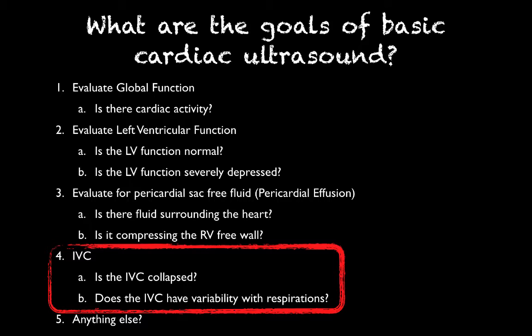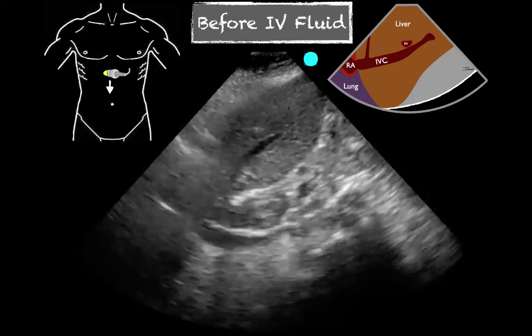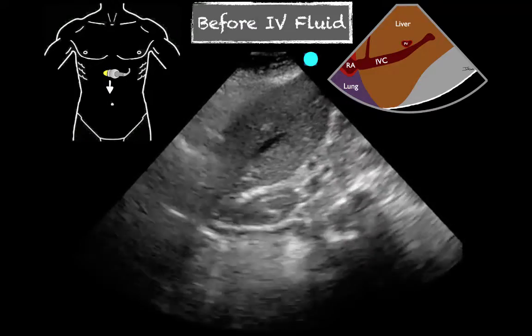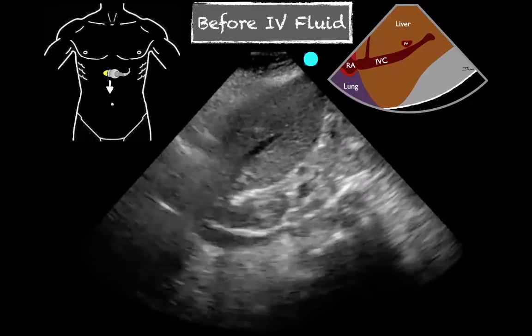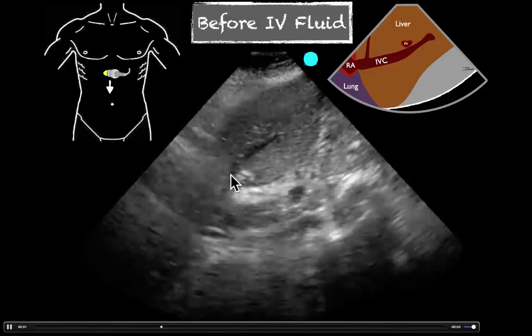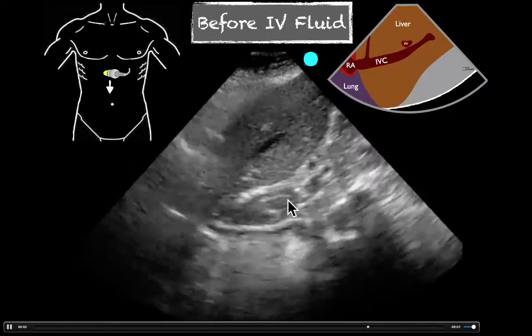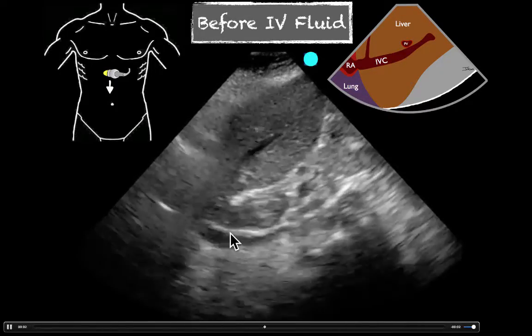In this example, the patient had a cardiac ultrasound first, which showed good function, and then some supplemental IVC views were obtained after some fluids. So we can see here: here's our liver, here's our hepatic vein coming down, here's our portal vein, and this little bugger right here is our IVC.